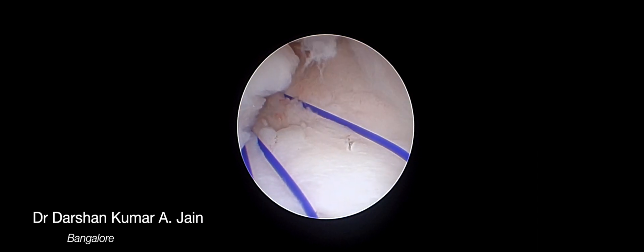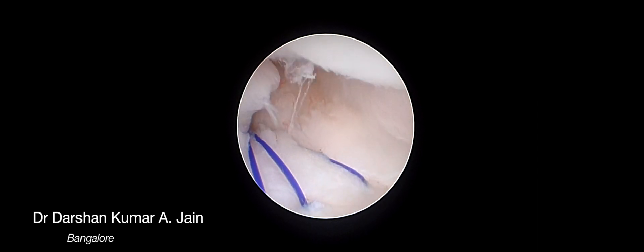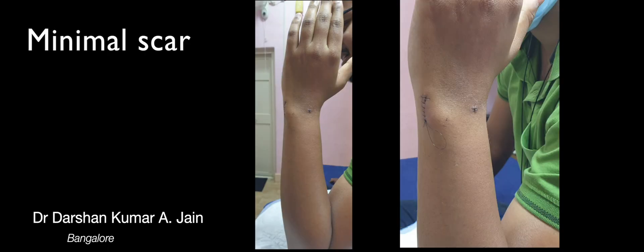Once the sutures are passed, they are tensioned and adequate tension at the TFCC is noted, meaning the repair is good and a good closure can be achieved.